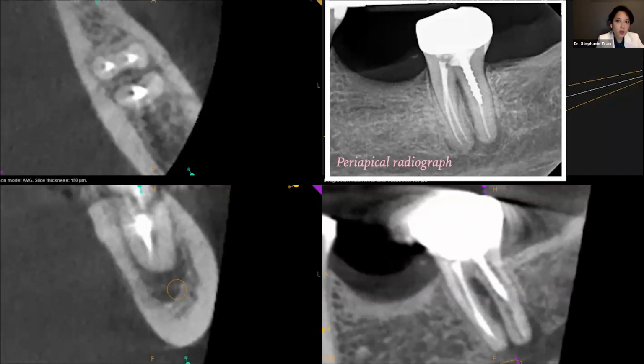But what are we looking for in terms of the bone loss? There's a little bit of furcation bone loss. Okay, that makes sense with that 5 or 6 millimeter probing on the furcation area. There's also periapical radiolucency. We can see that's close to the inferior alveolar nerve, but separate. And there's a couple areas of radiolucency: one in the furcation area, which we can see here, a slightly separate one here in the apical area, and then possibly in the mid-root as well. So definitely a guarded prognosis on this tooth.